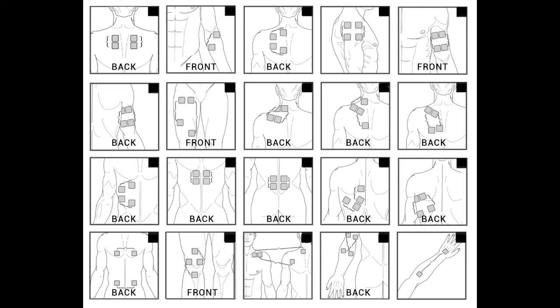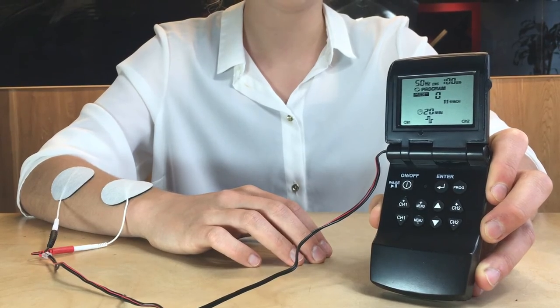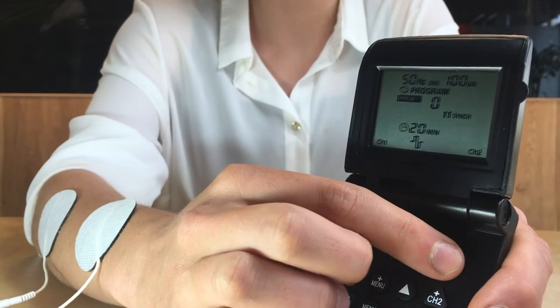Here are some of the most common placements for reference. You can now turn the device on by pressing the power button. The MK3 has nine EMS programs and three TENS programs. You can change programs by pressing the program button.